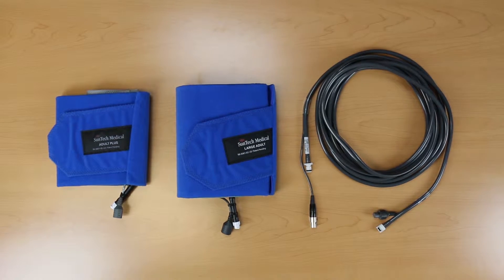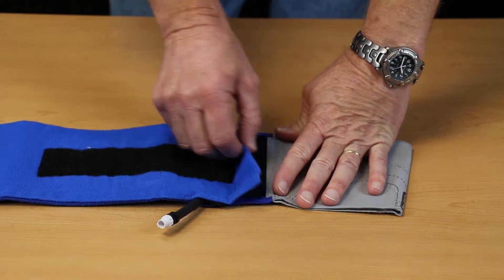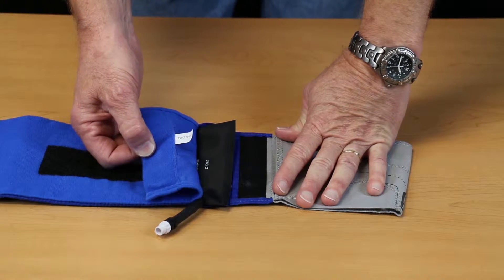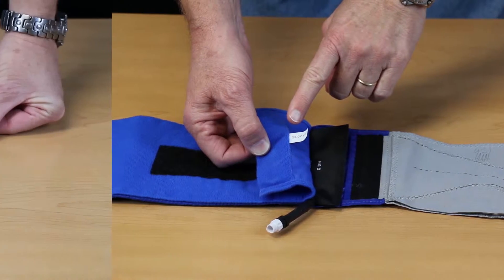If you aren't sure how old your accessories are, just follow these simple instructions. Open the cuff where you insert the bladder. You will notice a small white tag that will tell you the date the cuff was manufactured. If it is more than one year old, it is time to replace your cuff.